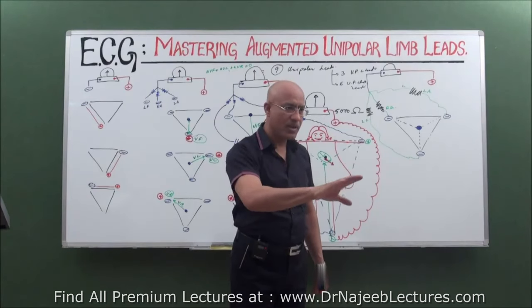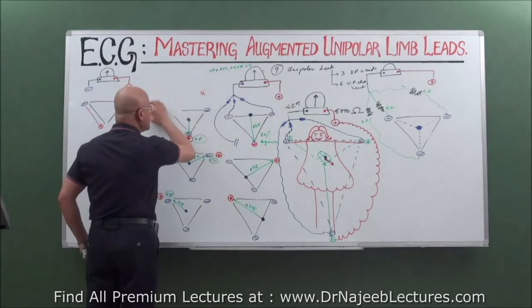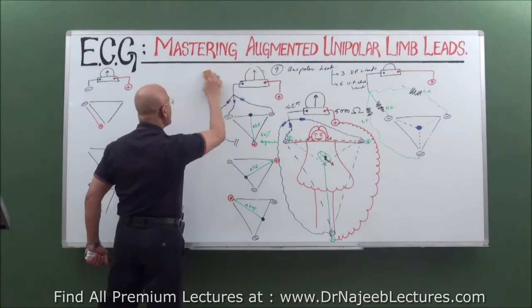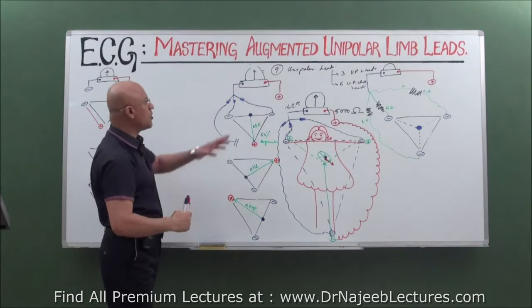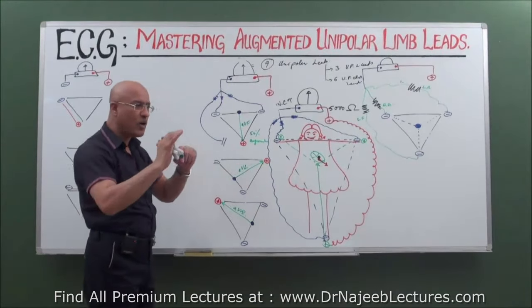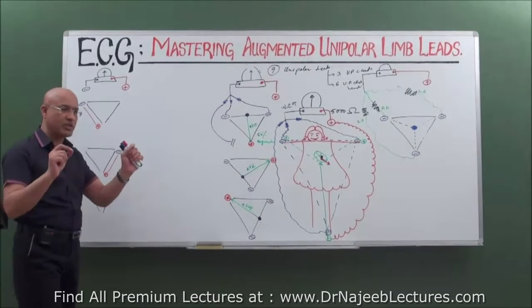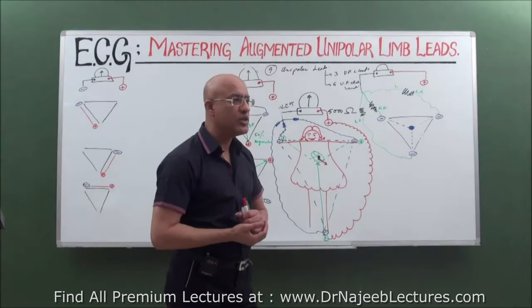You understand it? Now, once we have learned all this system, I can remove the Wilson system. Now we are left with bipolar limb leads, which are the Einthoven system, and augmented voltage limb leads, which are the Goldberger system or modified Wilson system. Is it clear? Any question up to this? Now, after knowing all these things, let's see what the patterns are. When these leads are detecting the electrical activity of the heart, what are the patterns drawn on the ECG paper?